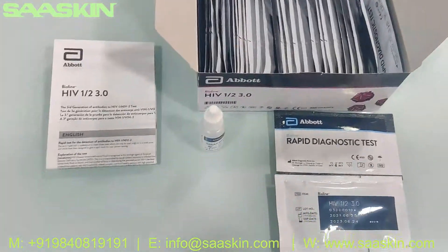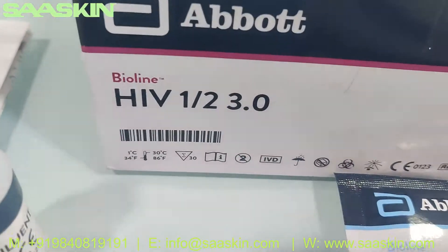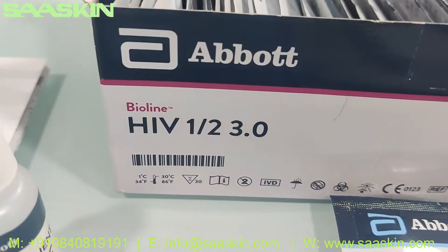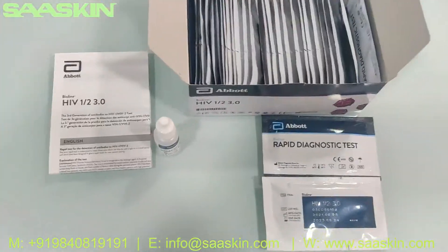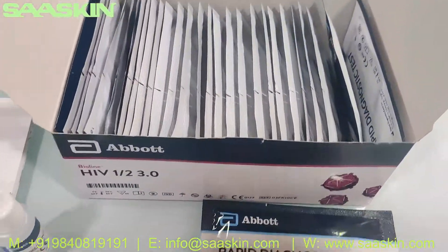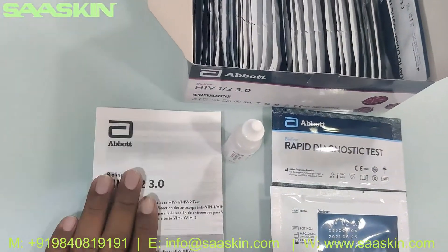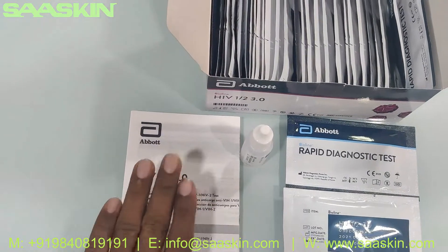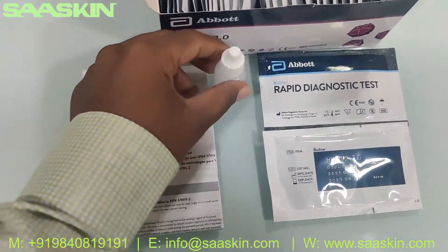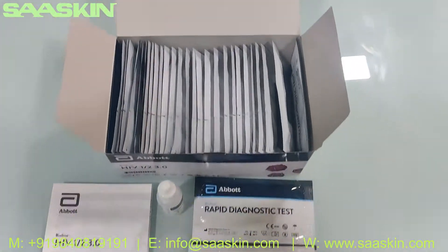This is the quick summary: Abbott Bioline 3rd generation antibody detection for HIV-1 and HIV-2. This test kit box is a 30 test kit box and a complete CE-IVD certified product. Inside you get an IFU brochure — a detailed brochure for completing the test and interpretation of the result — one buffer bottle, and 30 test cassettes. This is how the total box looks like. Thank you.